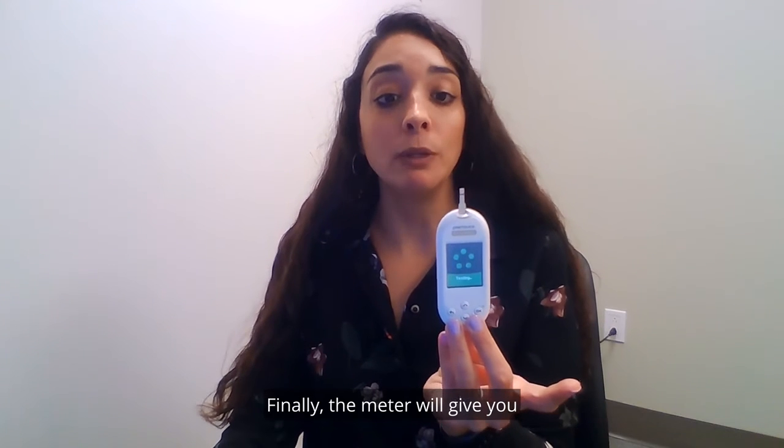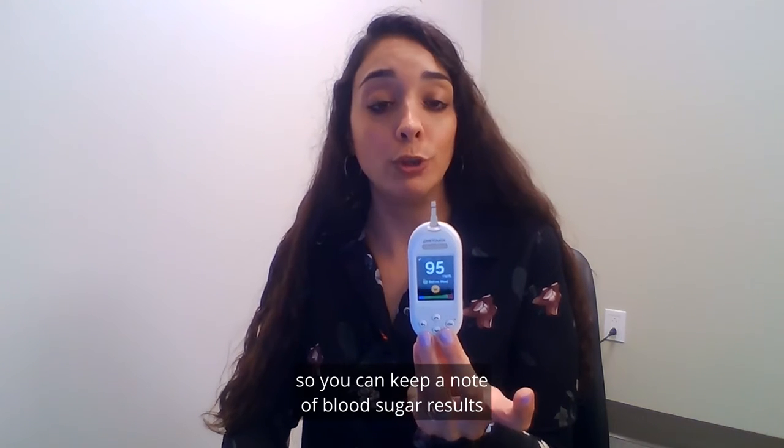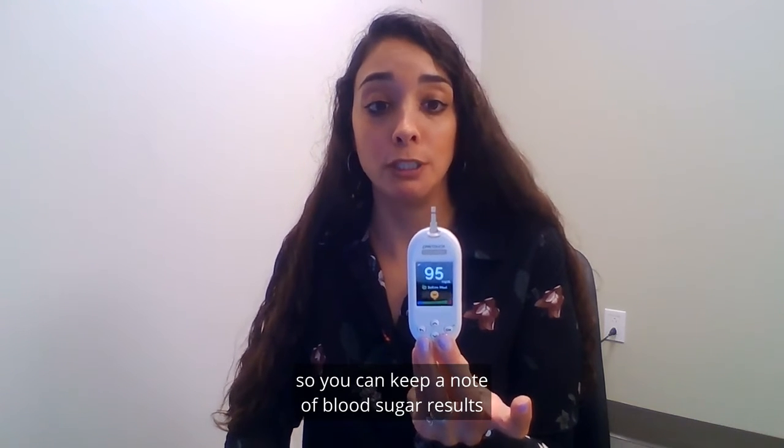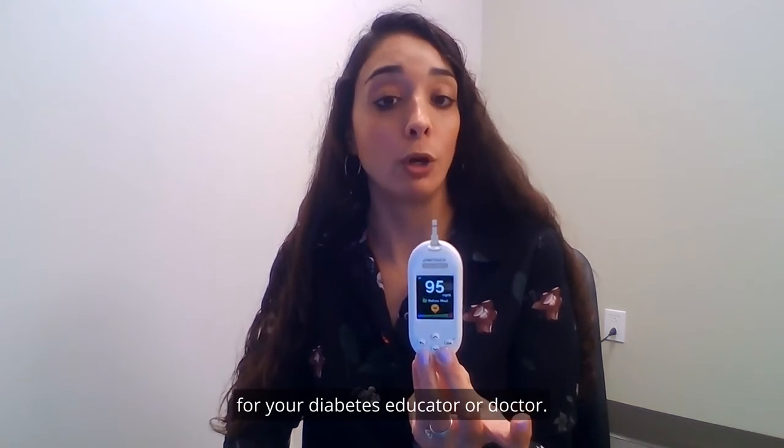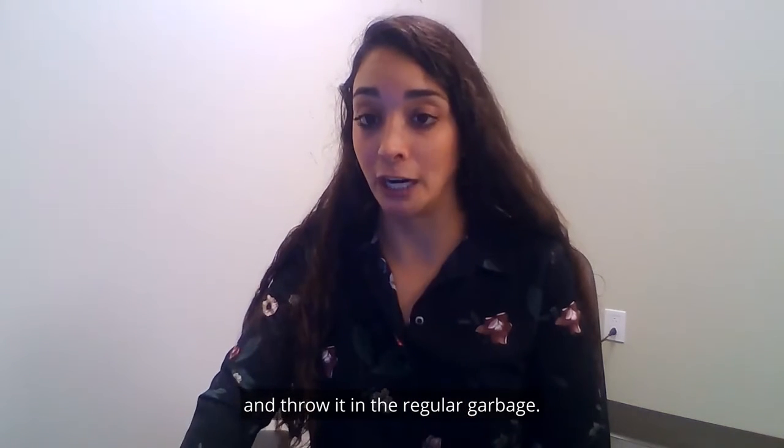Finally the meter will give you your blood sugar result, which you should write down so you can keep a note of blood sugar results for your diabetes educator or doctor. Once you check your blood sugar you can remove the strip and throw it in the regular garbage.